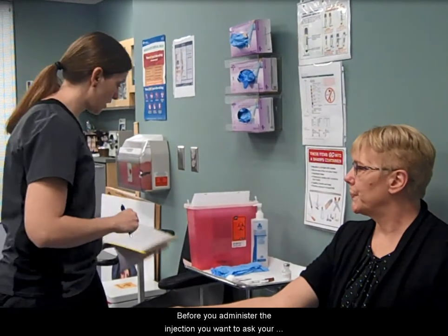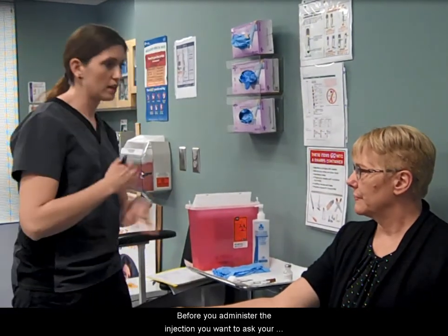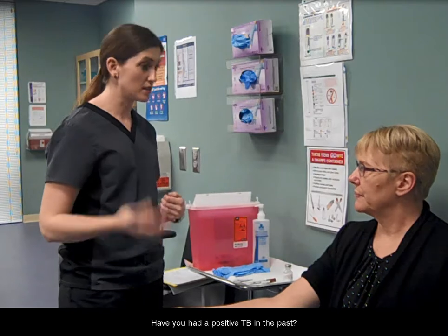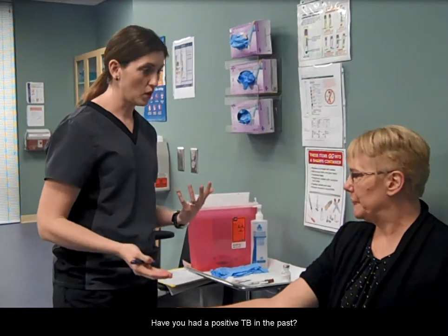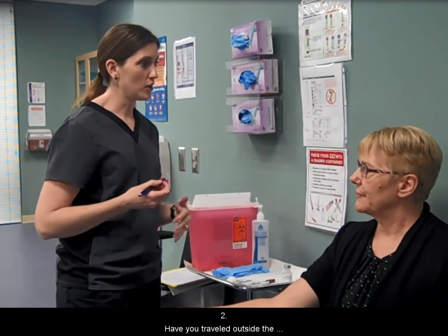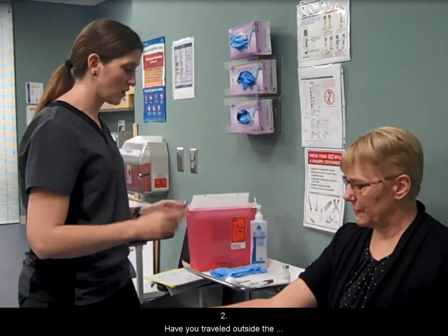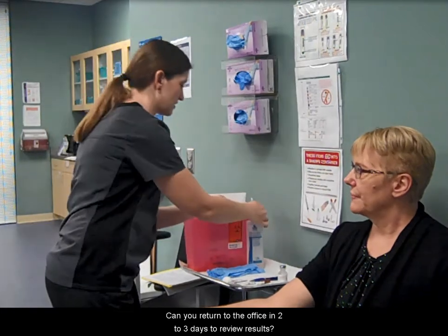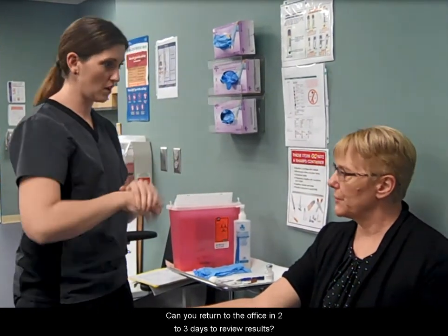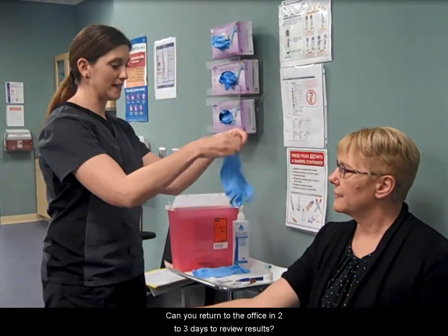Before you administer the injection, you want to ask your patient three questions. One, have you had a positive TB in the past? Two, have you traveled outside the USA recently? And three, can you return to the office in two to three days to review results?